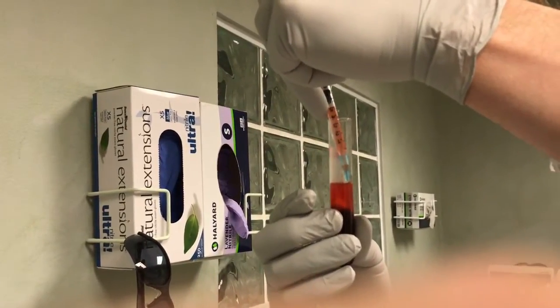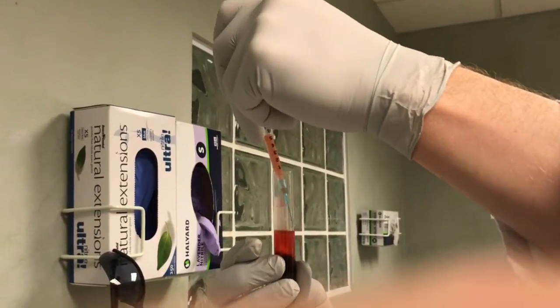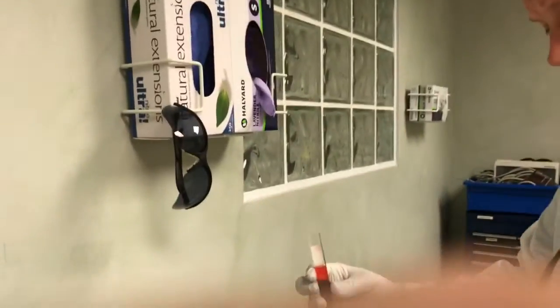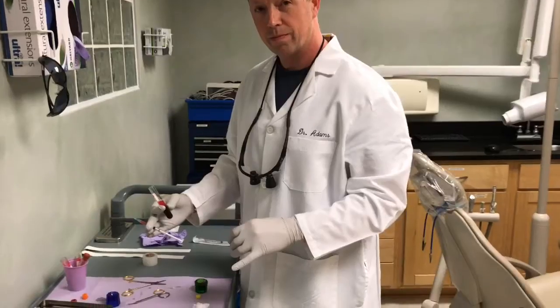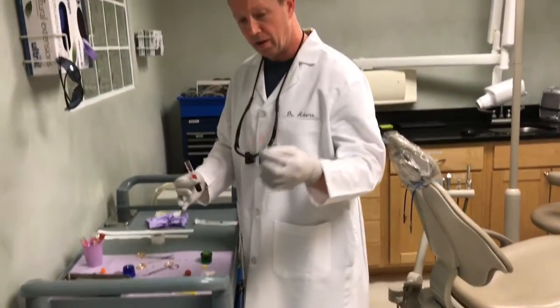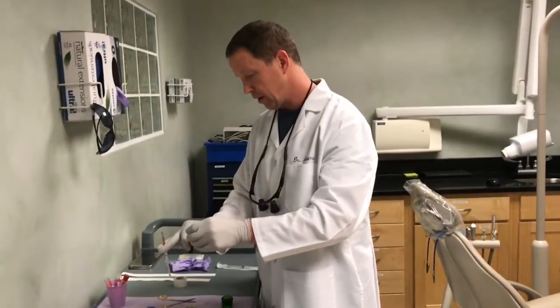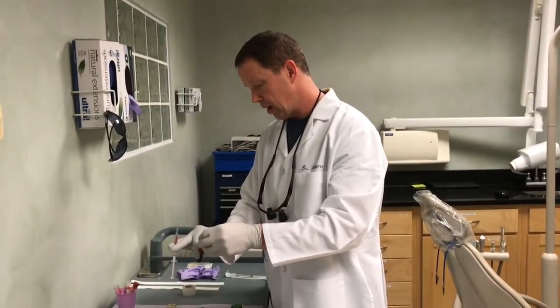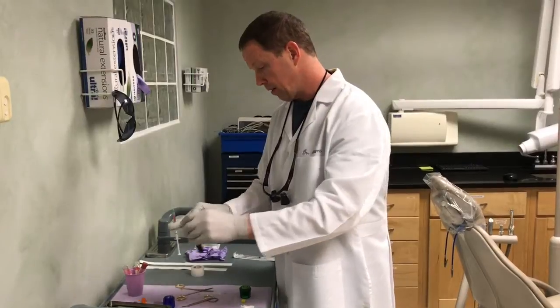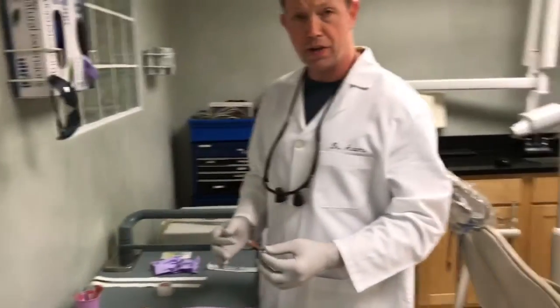The more yellowy this layer is, the better off you are. This is injectable PRF. The injectable PRF has a thinner, runnier consistency, and what you can do is inject it. For example, if somebody has a gum defect or gum problem, you can actually inject this down into the gum.